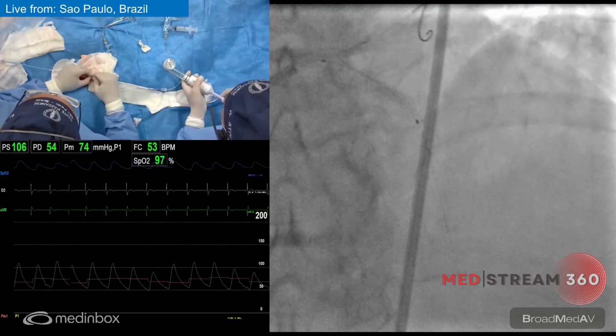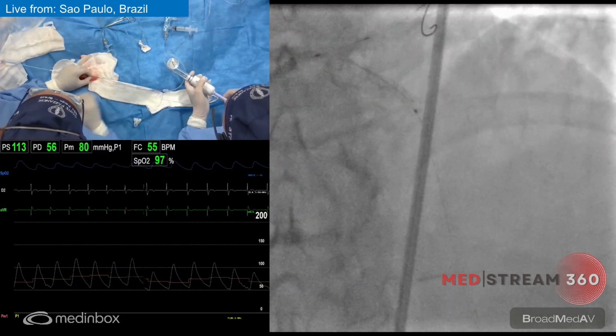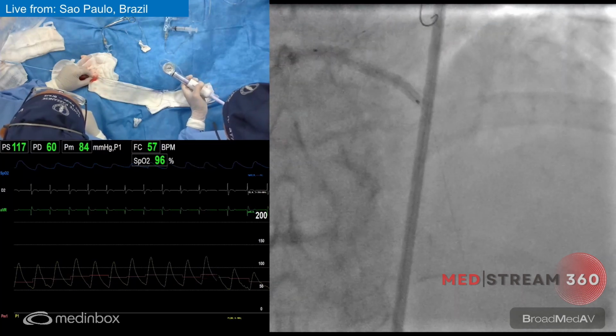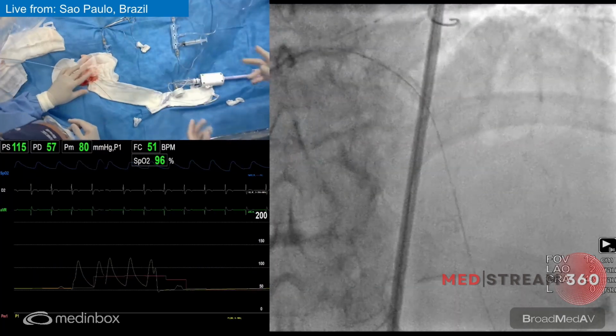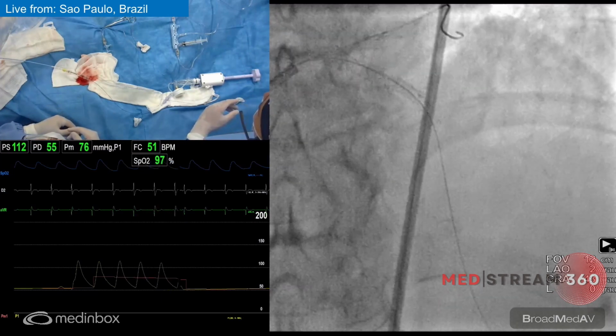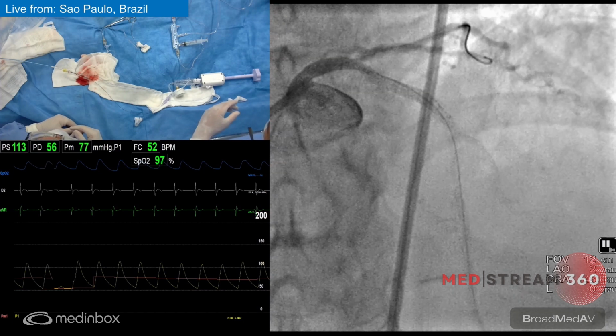Pull back 2 millimeters. Luis, you're going to pull back just 1 or 2 millimeters, and you're going to use the same balloon, Rodolfo, to post-dilate. Okay, so what pressure do you go now? Okay. The other stent, I think, go with a non-compliant balloon and post-dilate. I think it's just perfect position. I think it's very awesome, very precisely at the ostium.